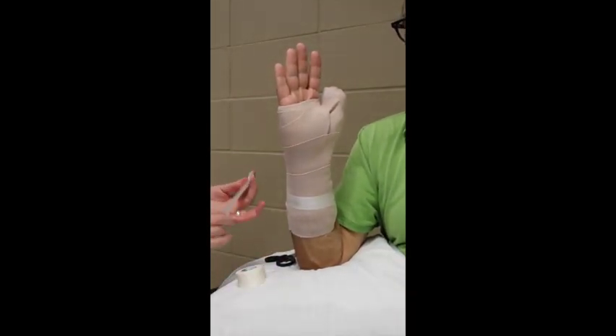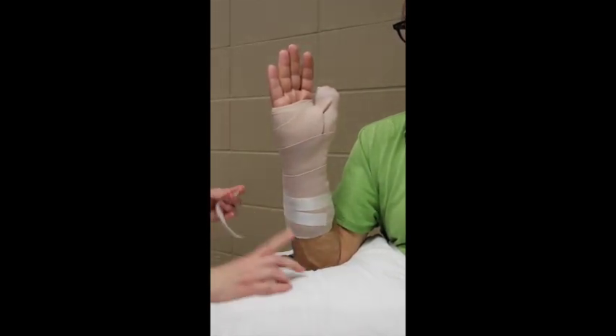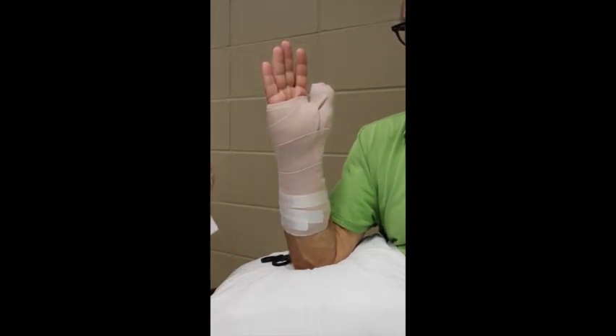I use this time to educate the patient on the three rules of having a splint: first, it should be covered with a plastic bag for showering; second, they should not shove anything inside the splint; and third, it should not be used as a weapon to hit people — I tell everybody that.